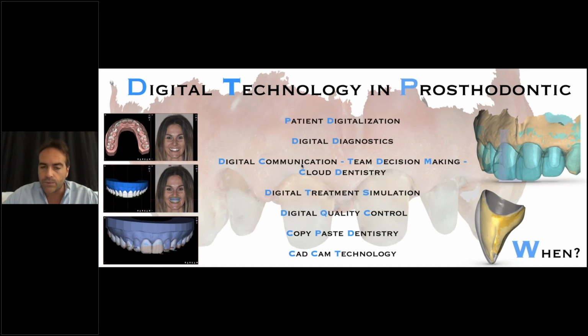We can, as I was mentioning to you before, have a quality control approach up front so we can prevent making mistakes. And then when we are finalizing the restoration, we will see this in a minute, we have the opportunity to do this copy-paste dentistry that probably has been the paradigm shift of digital dentistry, without forgetting where we started. CAD/CAM technologies that already 20 years ago increased the quality, increased the efficiency, and gave us the opportunity to work with state-of-the-art materials.